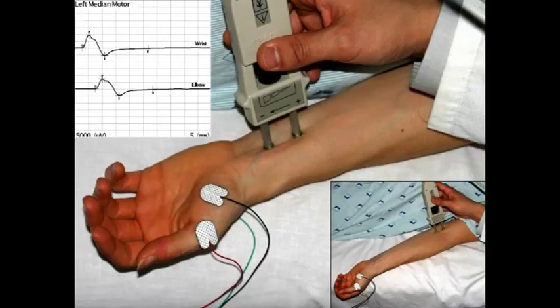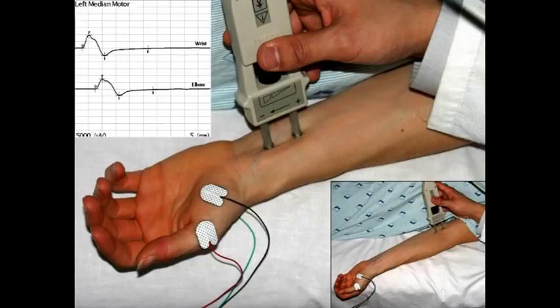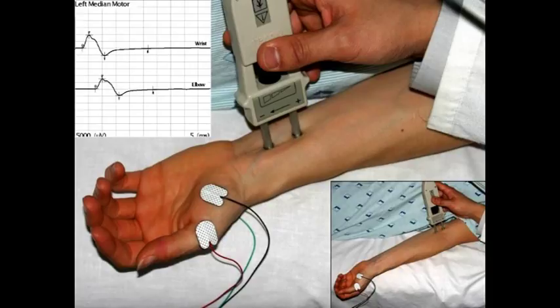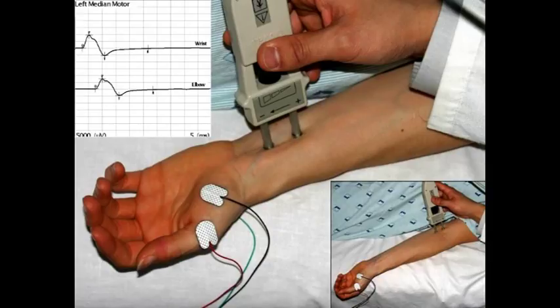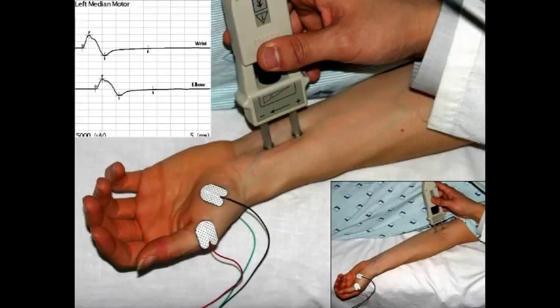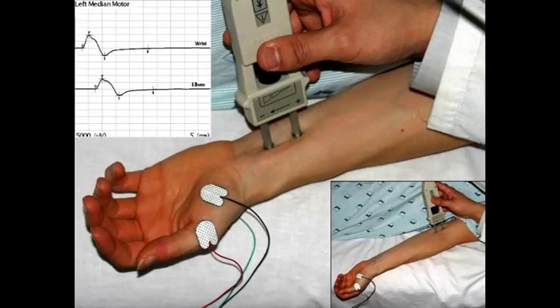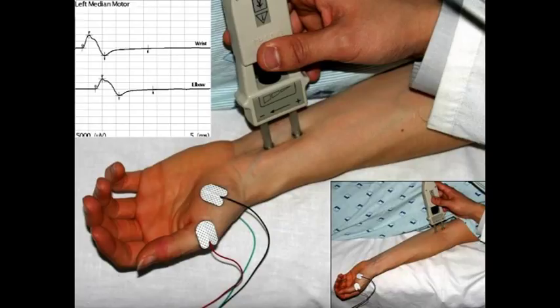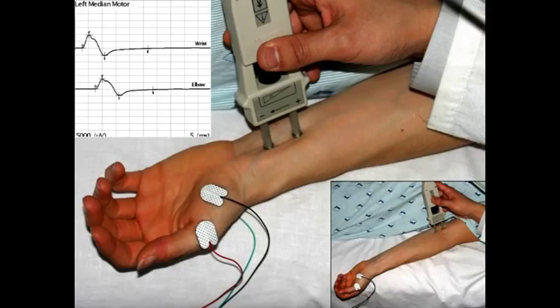To measure the true nerve conduction velocity, we stimulate proximally at the elbow and subtract the distal latency from the proximal latency, then measure the inter-cathodal distance. This gives us a true, pure motor nerve conduction velocity between those two points — 50 meters per second or over is normal. Neuromuscular transmission takes time too, which is why using two stimulation points is necessary.